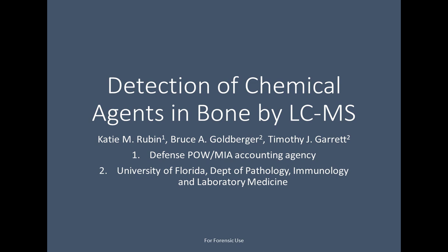And a second reason that I think is really important, we sort of showed this with method development for contamination, or rather, presence of citrate and other endogenous species that could interfere. When using a high-resolution platform for quantitation, patient samples are going to be highly varied, and it could give us the opportunity to find patient samples that fail in quantitative methods, and we could dig into the high resolution information and find out whether a specific type of metabolite is causing that interference that may be present in only a subset of patients.